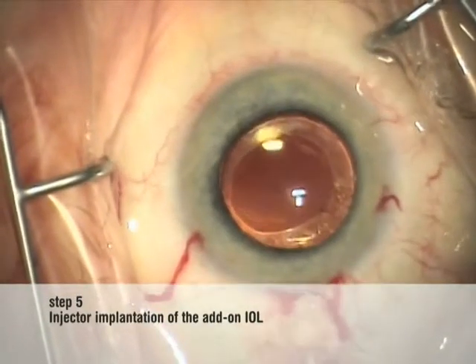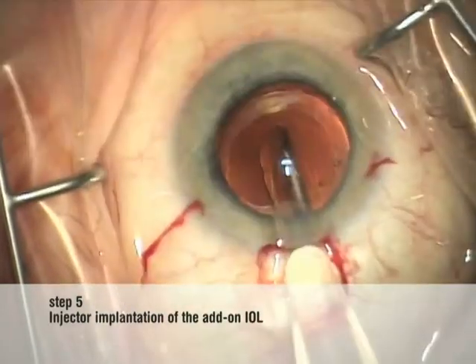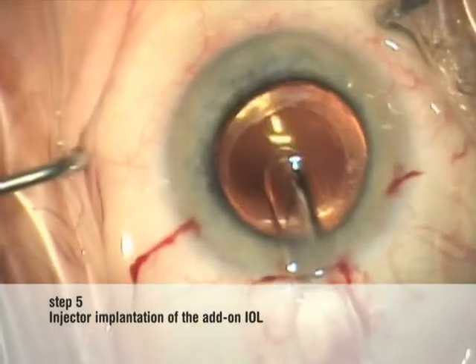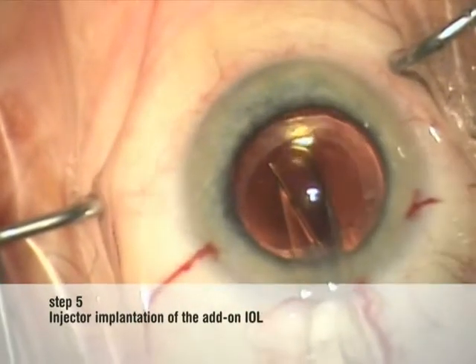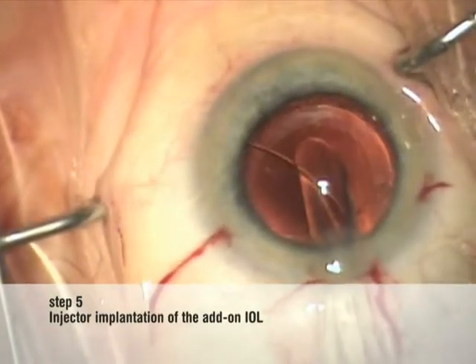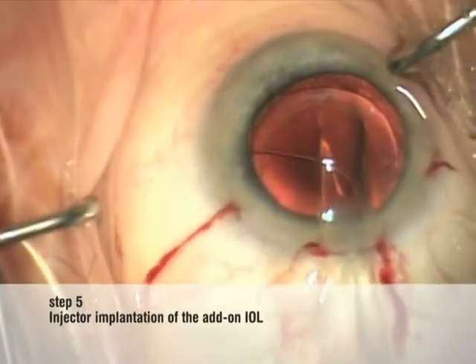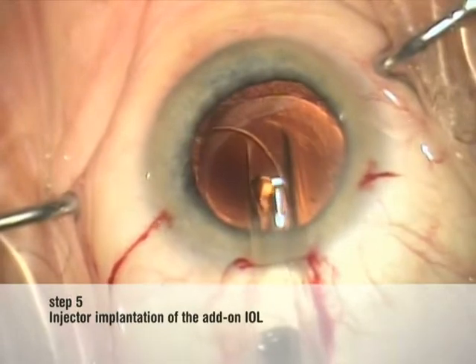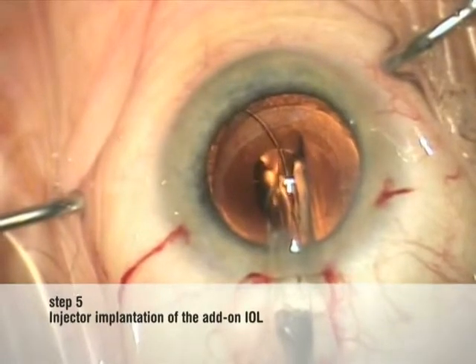First the injector is turned a little bit anti-clockwise to let the leading haptic slide into the sulcus. For the next step it is absolutely mandatory to turn the injector clockwise to the right, to let the silicone optic unfold slowly in the correct plane parallel to the capsular bag IOL. By not turning the injector clockwise one runs the risk of an upside-down implantation and even endothelial injury by the following PMMA haptic. It is also essential not to push on the silicone optic too much.